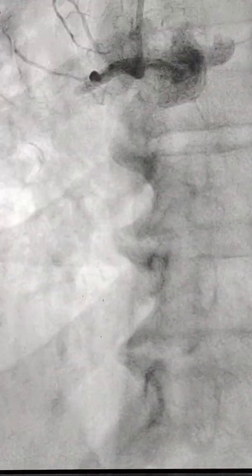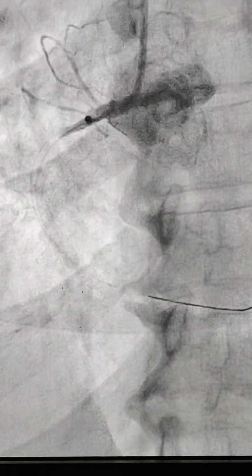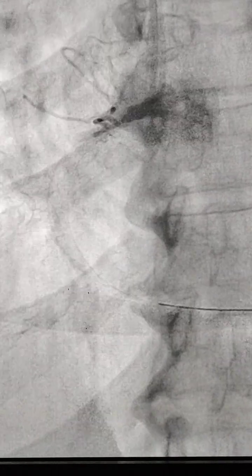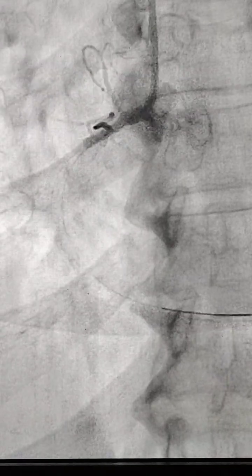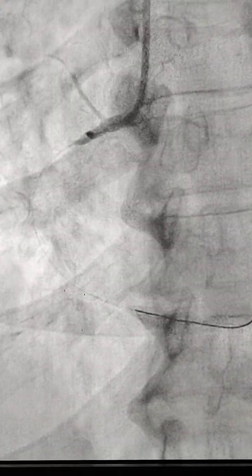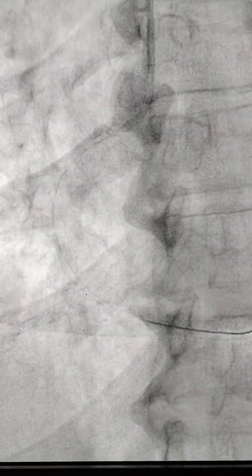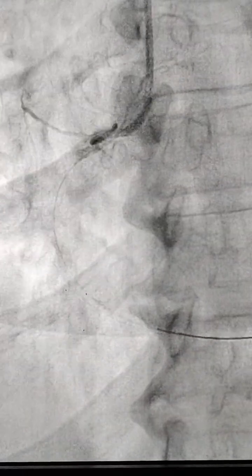Generally I do radial route because of fewer complications compared to the femoral route. So with the right radial route, this is a JR catheter, and this is a BMW PTCA wire. It was a cakewalk to cross the wire easily, and you can see after crossing the wire there is no flow even.